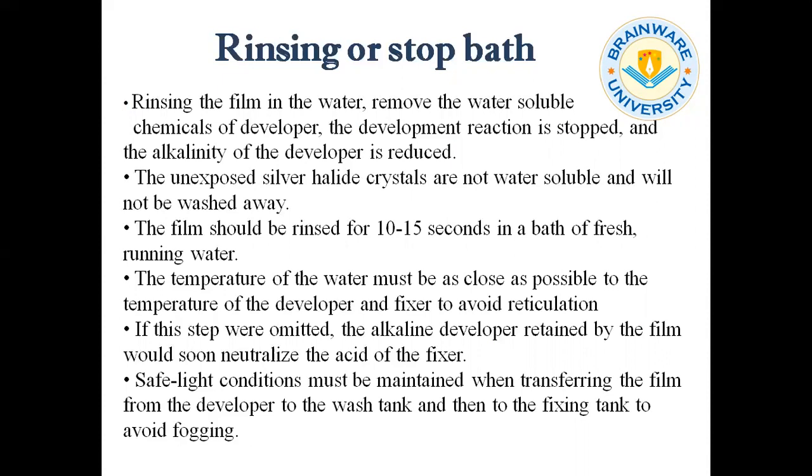If the temperature of the rinsing tank is high, development fog will appear in the developed film. So it is very important to keep the temperature of the rinsing tank constant and at the same level.